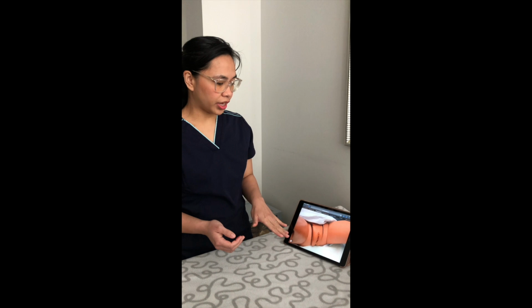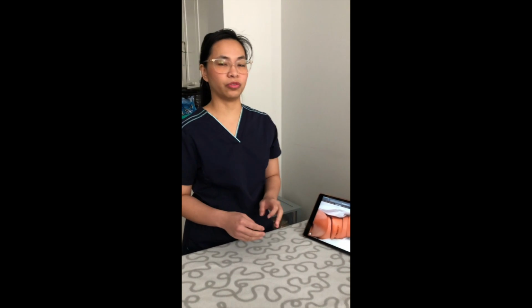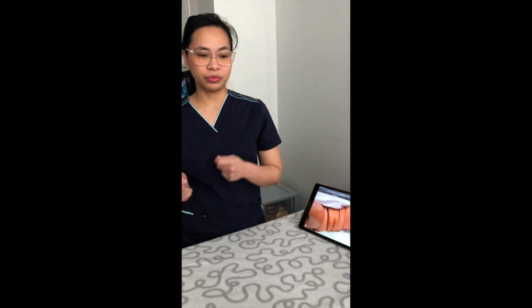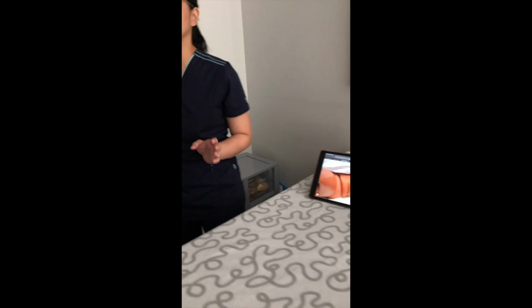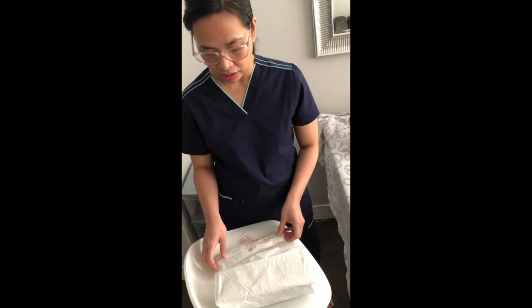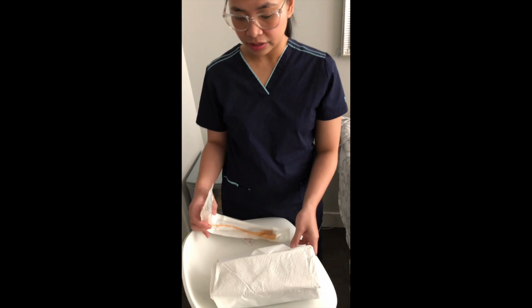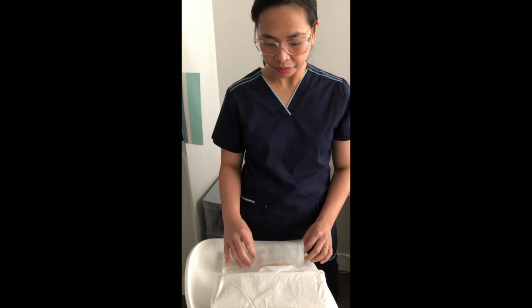Inspect the area for any odor, for erythema, and also the anatomy, so you can locate the urethra easily when you're inserting the catheter. So after that, you can remove your gloves, apply hand hygiene again, and gather all your supplies. So assuming this is the patient's bedside table, you can get your Foley catheter kit.